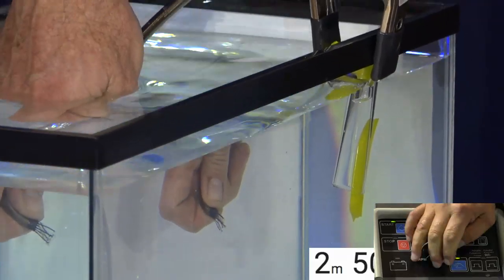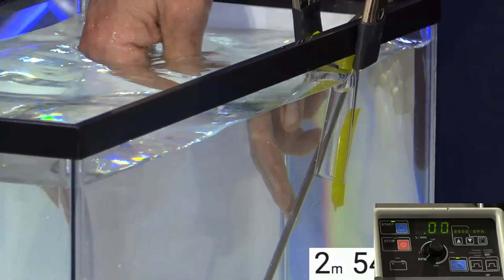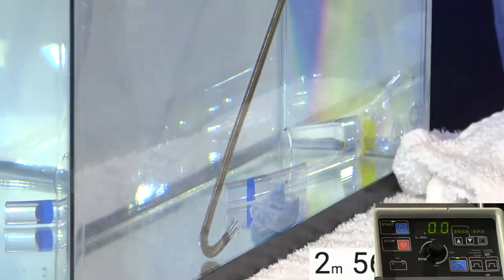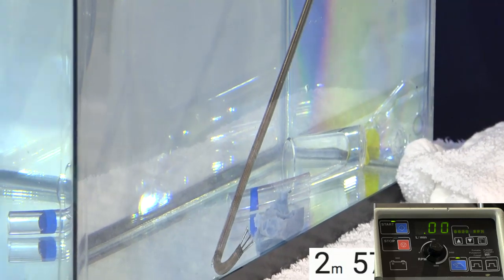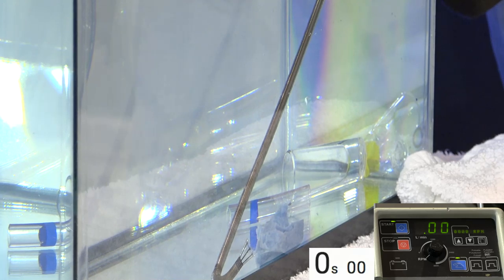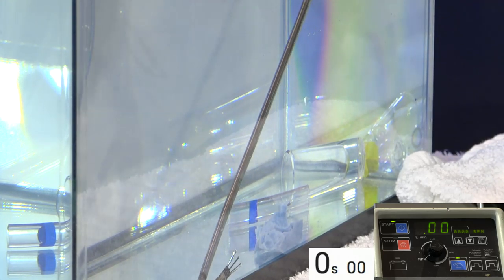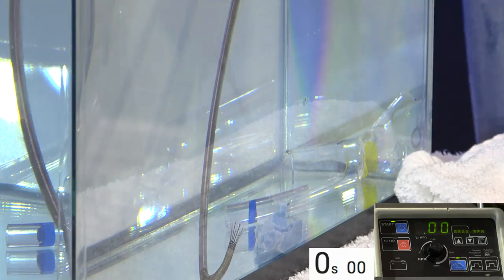So we managed to fill the patient full of air. This is a ridiculous example, by the way, because you'd never see a clot that big. This would have never happened. It's showing a lot, though. It's showing again the limitations of the simulated clot, but also if we can come back on flow just a little bit.